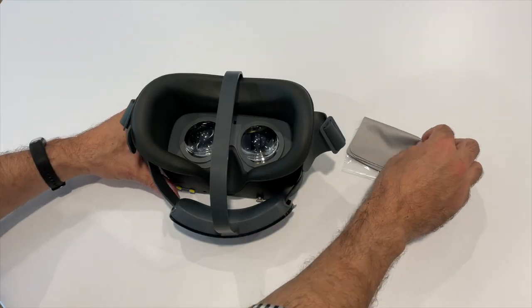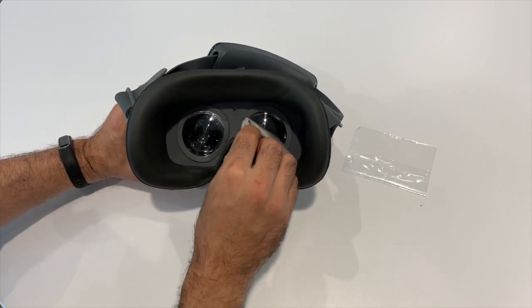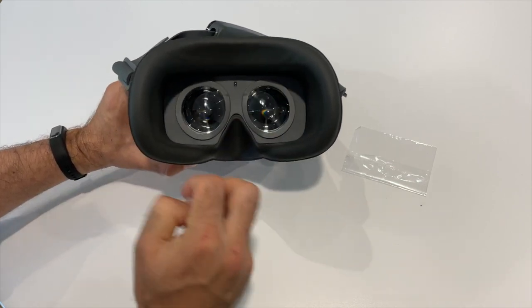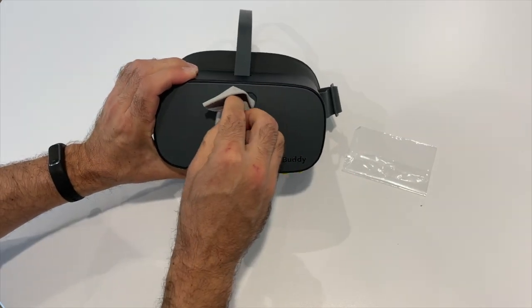For the best results of your headset, make sure to clean the lenses and camera regularly. Doing so often can help prevent dust or dirt buildup when watching TV or using the magnification mode.